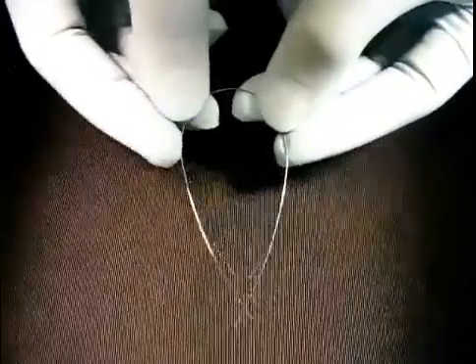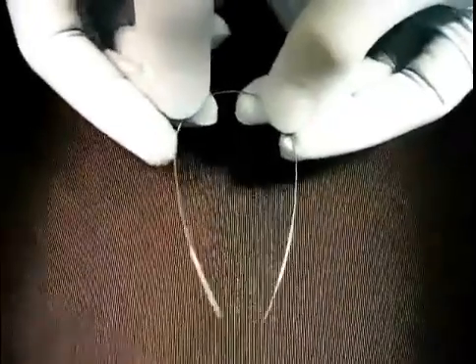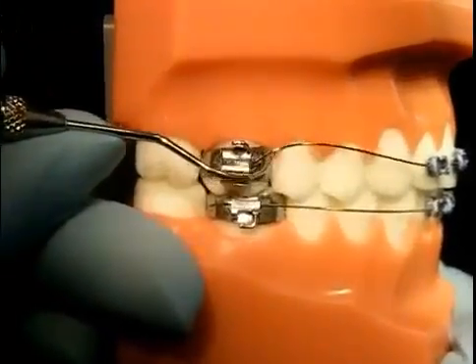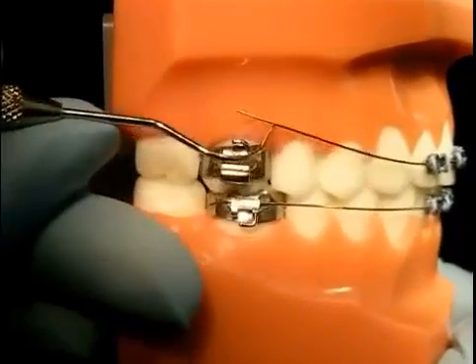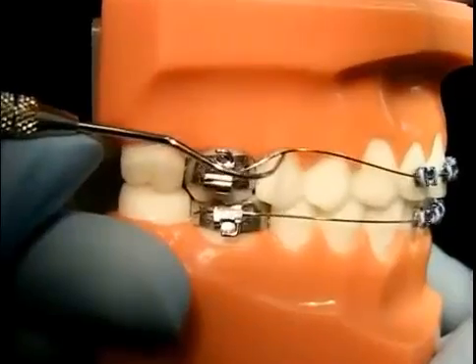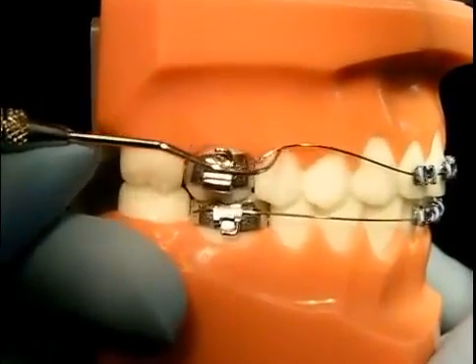During the beginning stages of treatment, flexible wires will be used to align your teeth. Sometimes, when you're eating, these wires can bend and pop out of the band or molar tube. This happens more often in areas with a long span of uncovered wire.